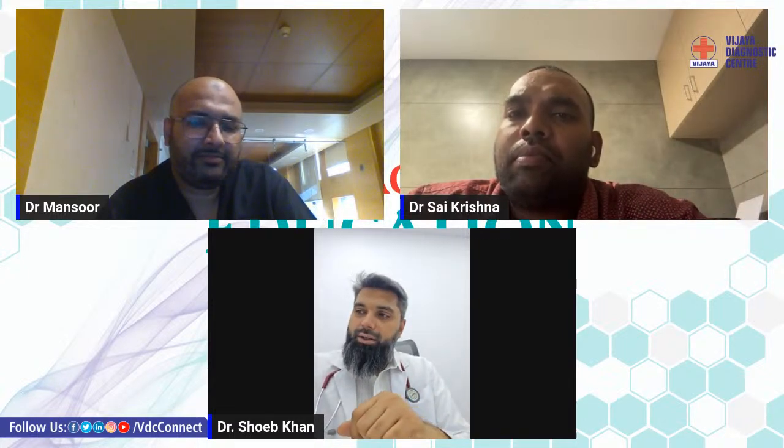Unlike exposing a small pediatric boy or girl to multiple X-rays and taking films while urinating, I think DRCG is a much better investigation modality. So anybody who gets a UTI once, if in the pediatric age group, needs to be evaluated for reflux, and that needs to be followed up with DRCG.